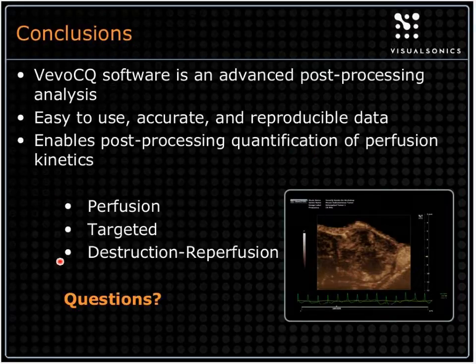There's a number of different modes available: perfusion, targeted, and destruction reperfusion. In the demonstration portion, I'll give some examples of standard bolus perfusion and destruction reperfusion. And we'll open the floor up to a questions interlude. If anybody has anything that they would like to know, please go ahead.